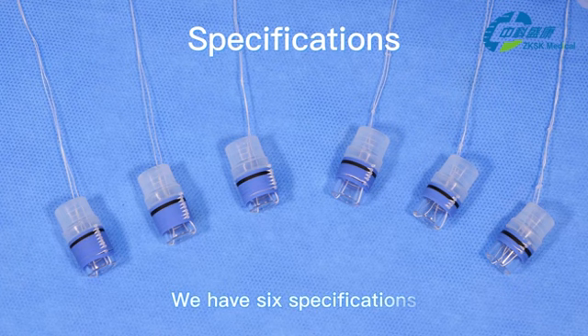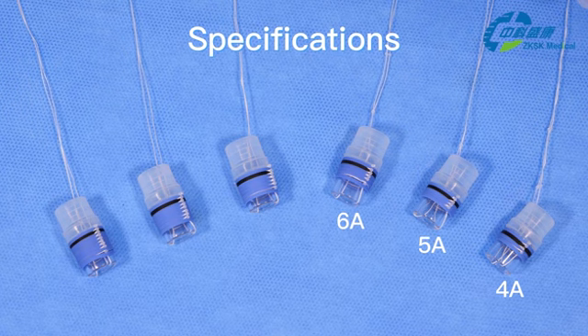There are six specifications: 4 bands, 5 bands, 6 bands, 7 bands, 8 bands, and 9 bands.